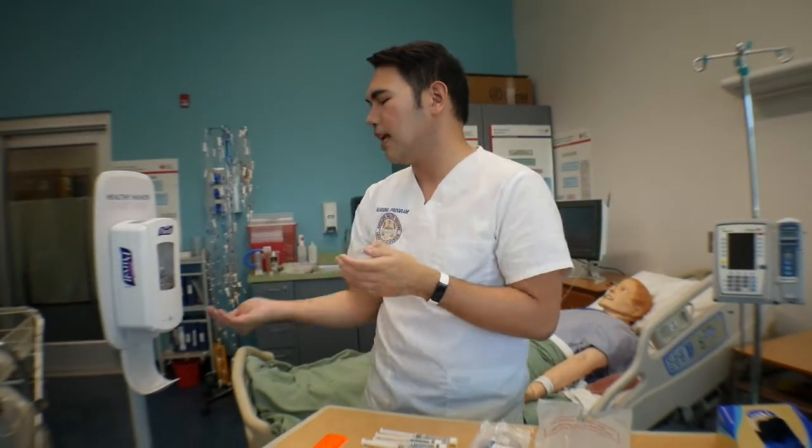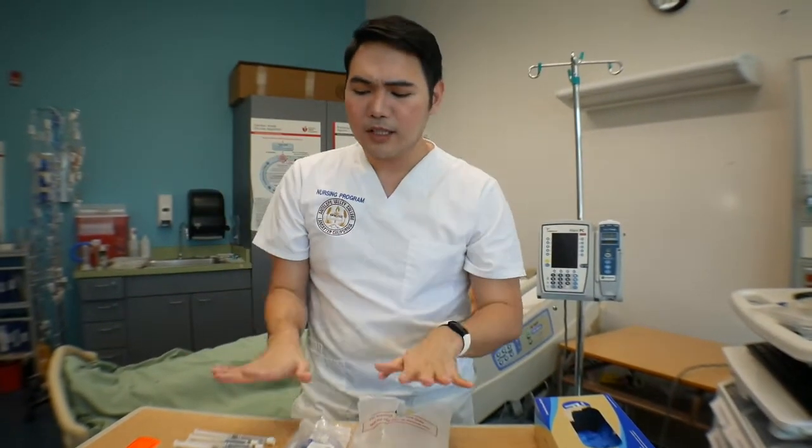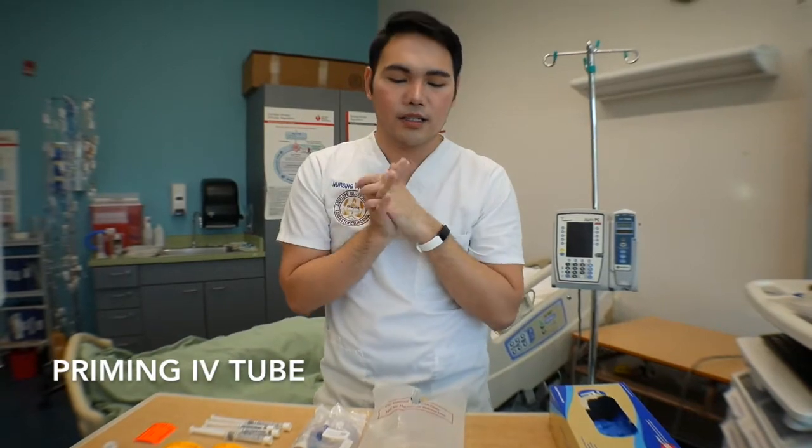After that, I'm going to make sure my hands are clean. I've already washed my hands, but to be sure, always get some hand sanitizer to clean your hands. While you're doing that, you always have to think about your 6 rights of medicating a patient: right dose, right route, right time, right patient, right medication, and right documentation. With this process, you don't need to use your gloves yet since you're only preparing the bag and the tubing. But once we get into infusing it, you actually have to put your gloves on.